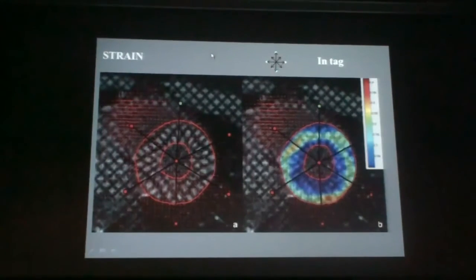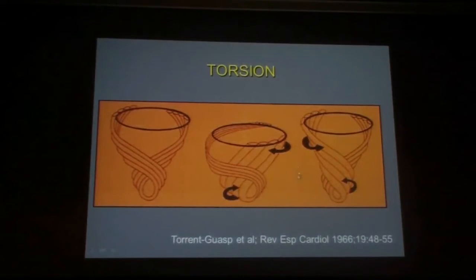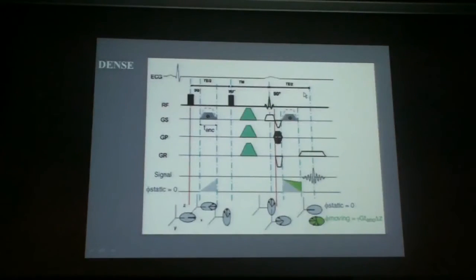They're very useful in clinical practice to identify processes that will only touch the subepicardium or subendocardium depending on the disease. And they're also useful to analyze the torsion motion of your heart, which is in fact not a very simple circumferential motion as you can see on MR images. It's much more complex. You can compare that to a piece of towel that you squeeze to remove the water. This is exactly what's happening in the heart. There is a squeezing of the myocardium that is the best way to remove the blood from the inside, and that you can analyze using these strain reconstructions.